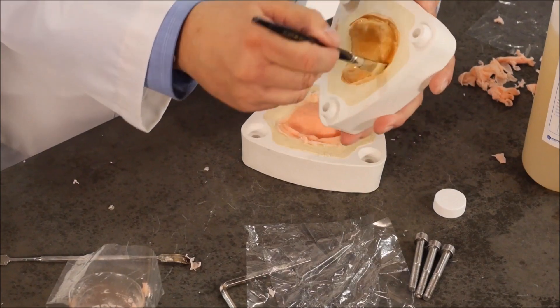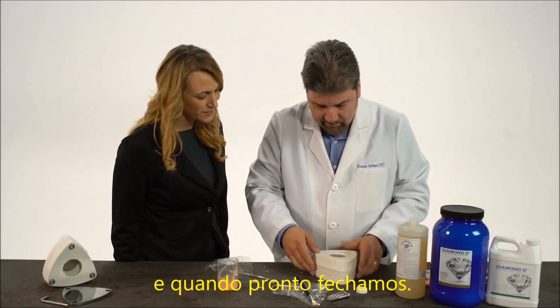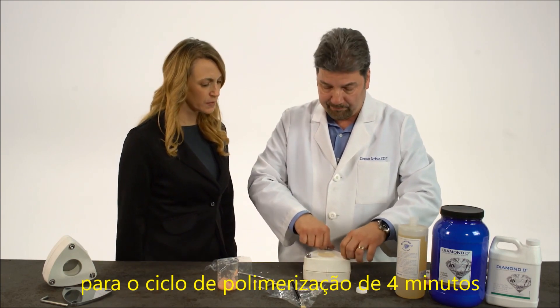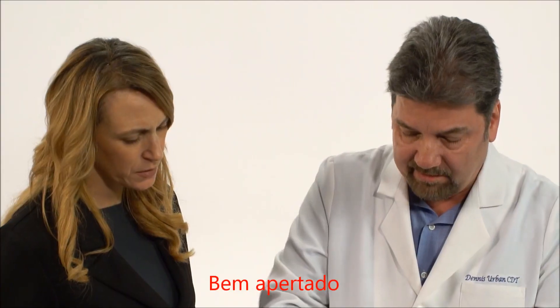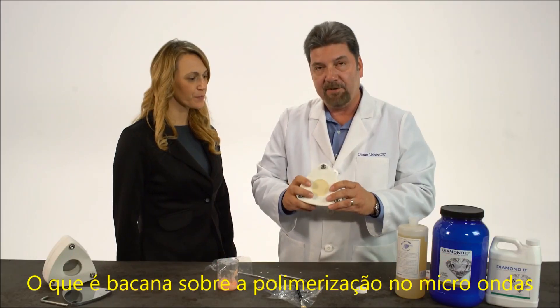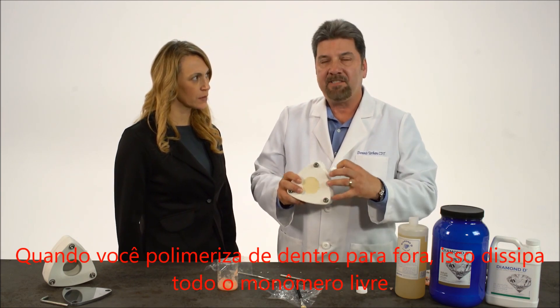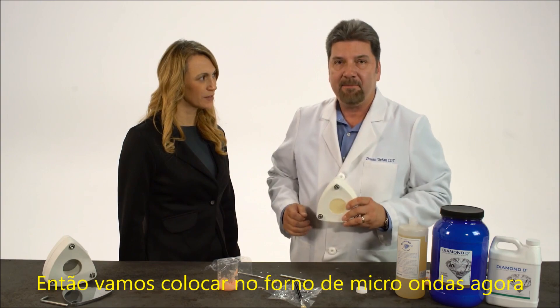I'm just going to coat that very lightly, and then we're ready to close. Close that up, we're going to tighten it down, and then we'll put it in the microwave for a four-minute cure. Your packed denture is all ready to go to be microwaved. What's great about microwave curing is it cures from the inside out, as opposed to other methods of curing which cure from the outside in. When you're curing from the inside out, it dissipates all the free monomer. So for patients who are allergic to monomer, this is an excellent remedy. So let's go put it in the microwave now.